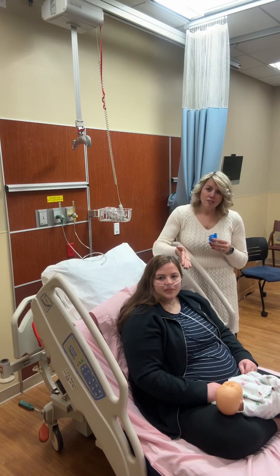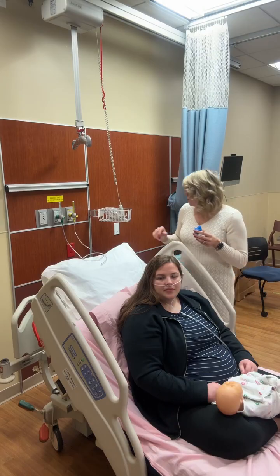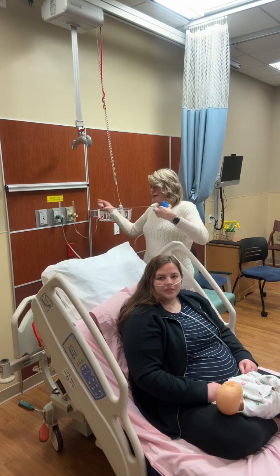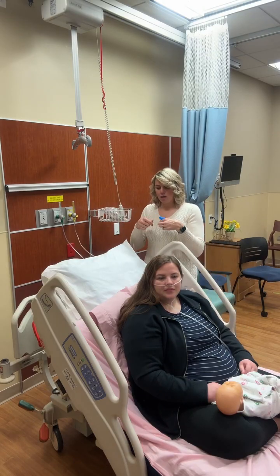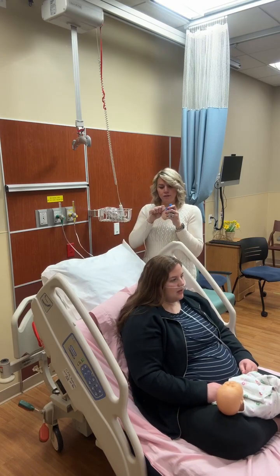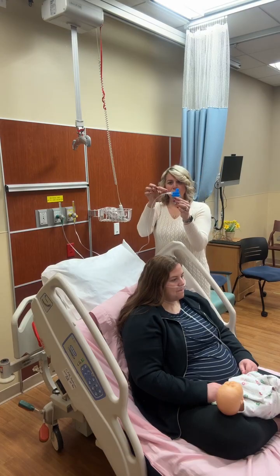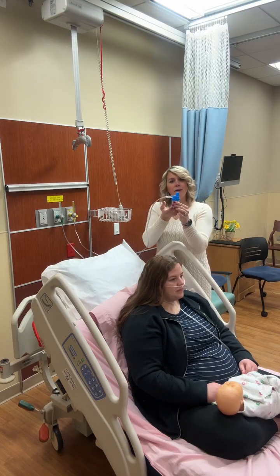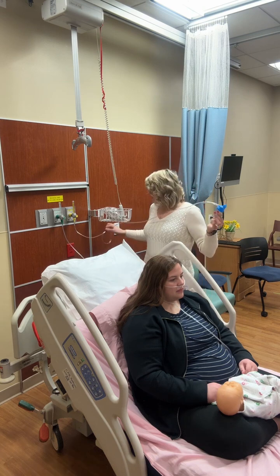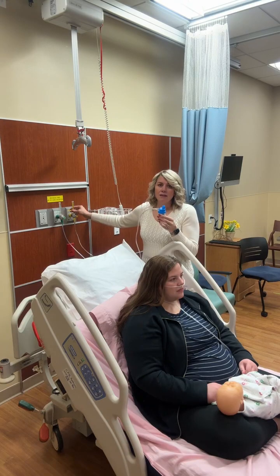We're going to keep the oxygen on. We are not going to remove the oxygen. She's on 2 liters of oxygen. We are going to connect our O2 tubing to the cup, and so sometimes the cups have the little ports on the side, sometimes they're on the bottom. This one is on the side, and we are connected to air. We're always going to give the neb with air unless we have no other choice but to use oxygen.